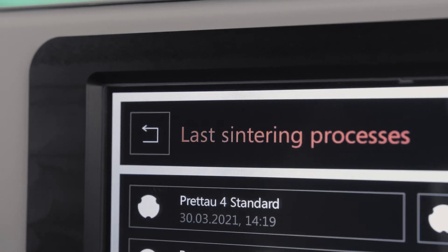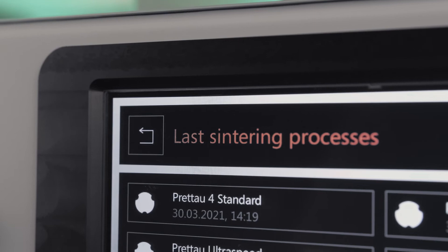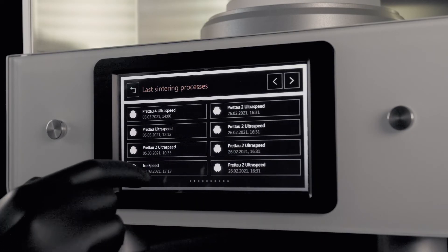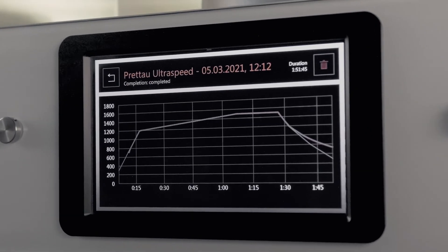In order to monitor and trace back the sintering cycles, we added the history function. In this way, sintering processes for up to 50 programs can be analyzed retrospectively.